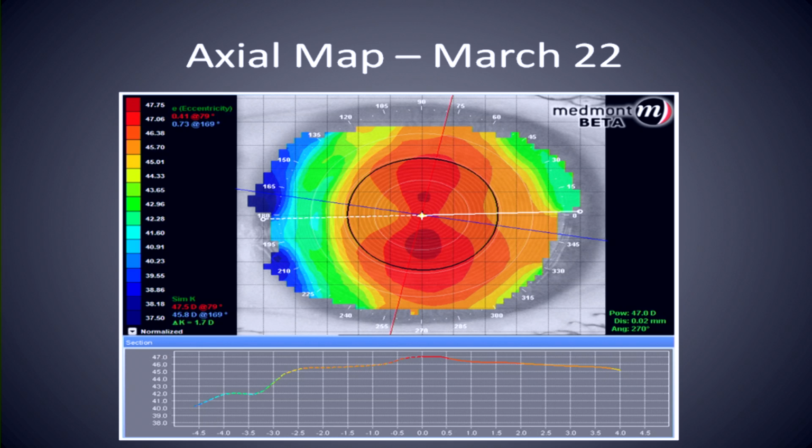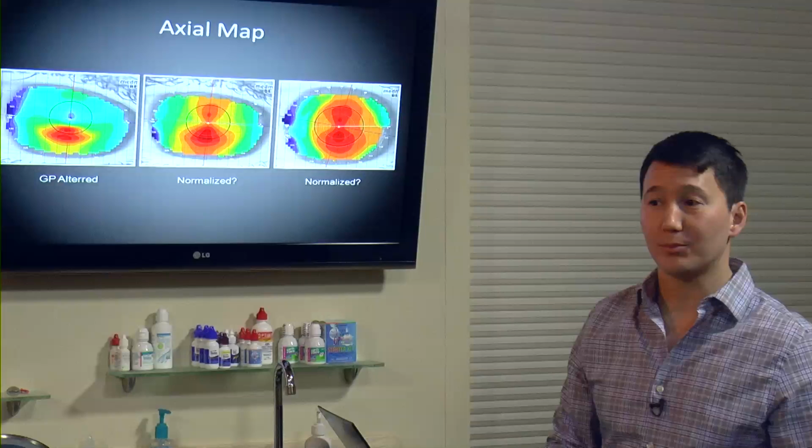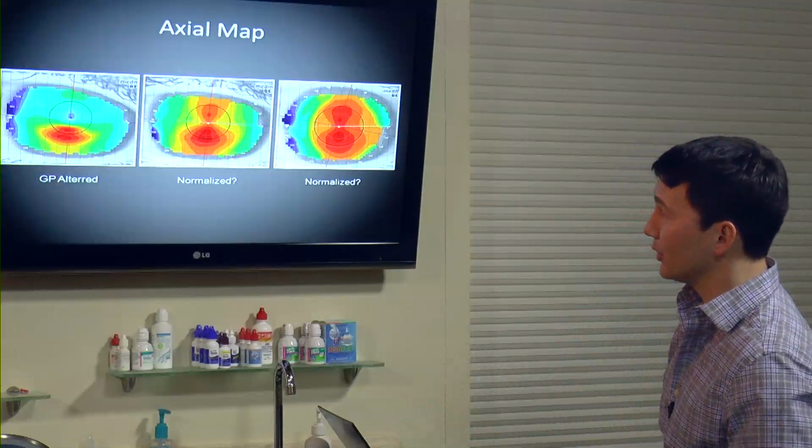And I think because we see this nice figure 8 astigmatism, we can say our lens is likely appropriately vaulting the apex. The eye is smooth and it's normal in its astigmatism. When we pull up the tangential map, that might tell us if our lens still has some molding. And RGPs mold the eyes. We hope they mold them in very small ways, but it's typical for some molding to happen.